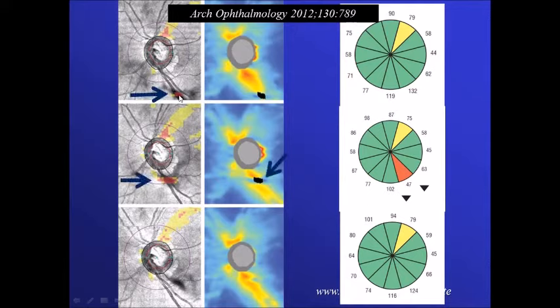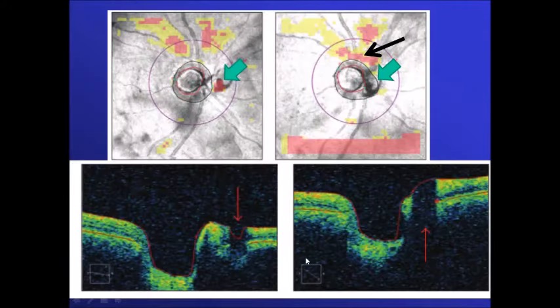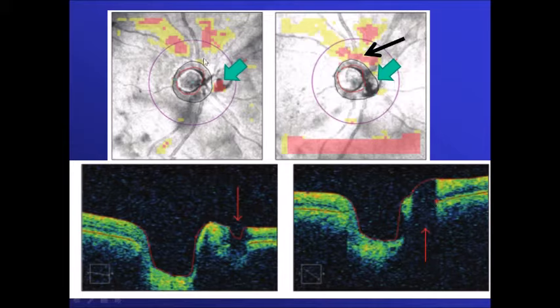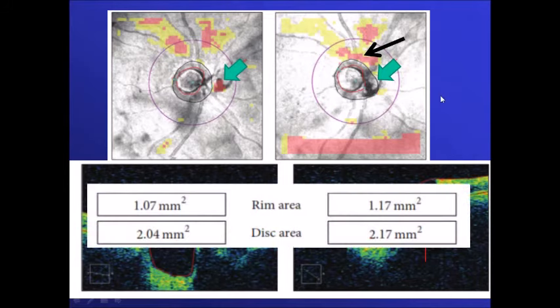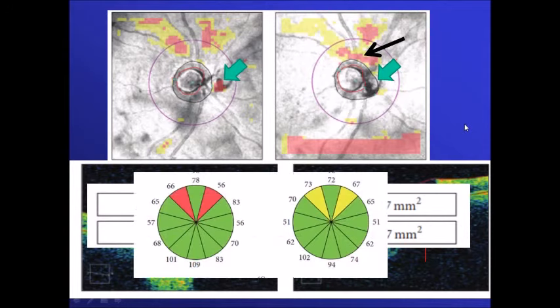With a vitreous opacity that moved over the ring on repeat imaging, a low signal artifact appeared compared to the original scan. In another example, an opacity was included within the area used to measure disc size, causing the machine to calculate a larger-than-normal disc. This changed the disc limits, rim area measurement, and ring location, producing different sector measurements between the two readings.